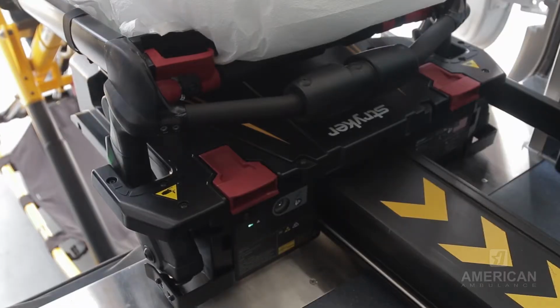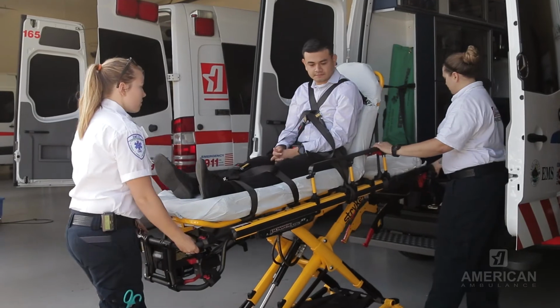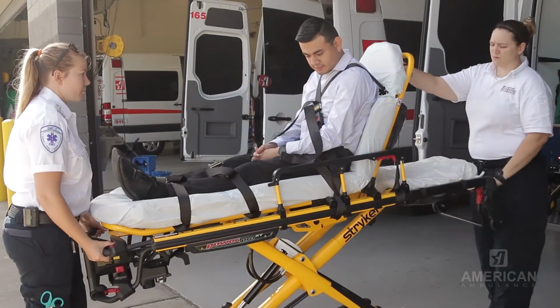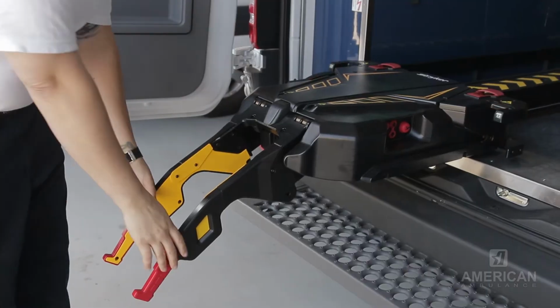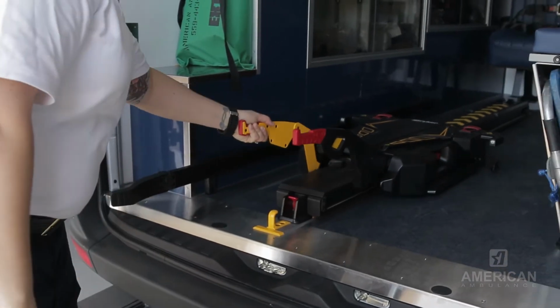You're going to do that by pressing the release handle at the front end of the gurney. Crew member will unlatch the gurney, and the gurney will then be able to unlock and move away from the ambulance. There's a couple of things you need to do before you can walk away. Number 1, drop that gurney into the transport position and brake it. Second, crew member is going to walk up, lift up on the glide arms to release the brake to move the glide system back inside the ambulance.